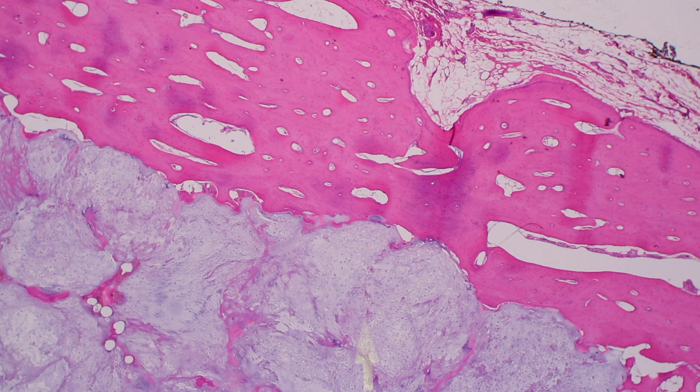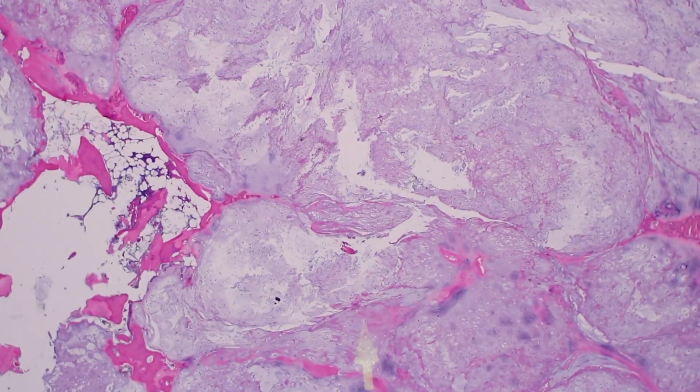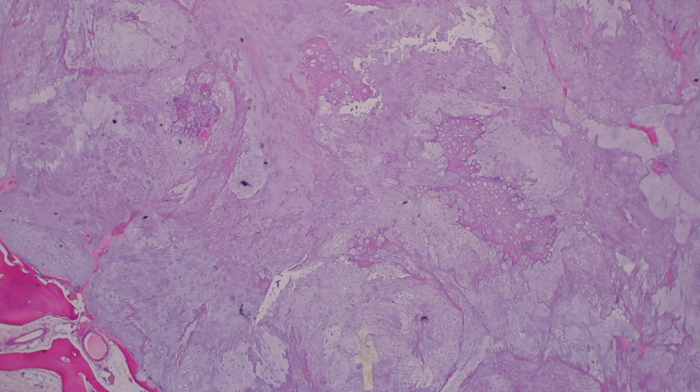The other features I use are infiltration, which up till now I have not seen, the degree of cellularity, and the degree of cytologic atypia manifest by the chondrocytes. So up until now, when I look at this large cartilage tumor, and it is large, it's going from the metaphysis into the diaphysis, I would argue, at least now with this superficial look, and I tend to be very conservative in my interpretation of cartilage tumors, that this is a big enchondroma.